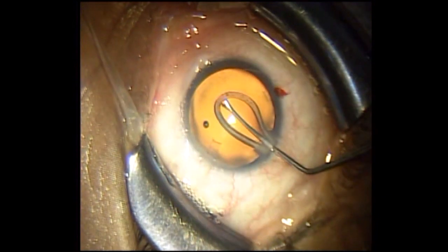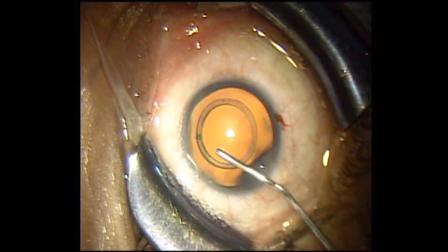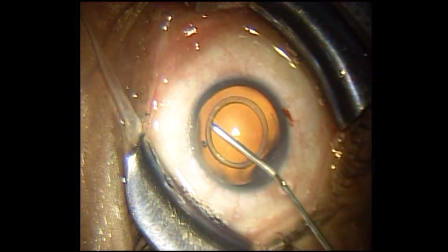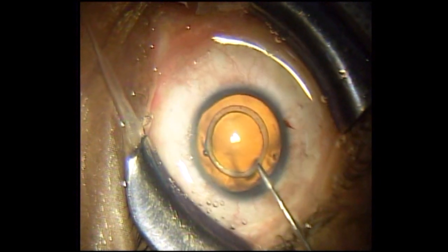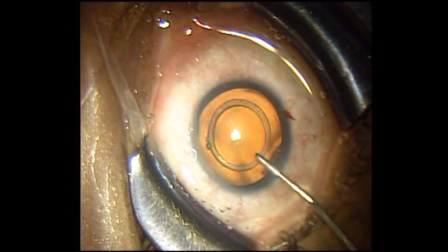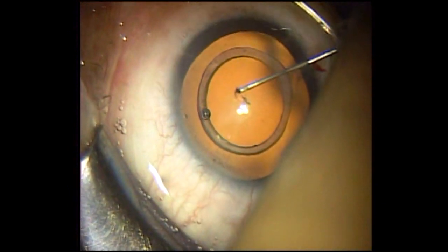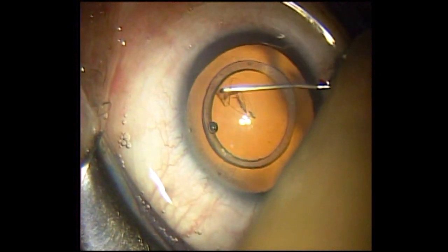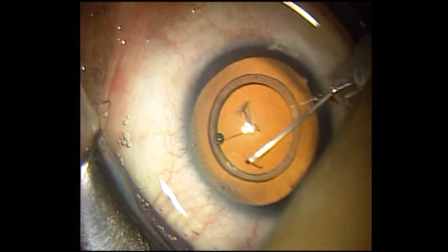Once the CCC caliper is introduced inside the eye, you need to inject some more thick viscoelastic into the anterior chamber to make the CCC caliper centralized on the anterior capsule of the lens. Once the CCC caliper is well centralized, you can start CCC with the help of a cystotome. Here you can also use a CCC forcep instead of the cystotome.